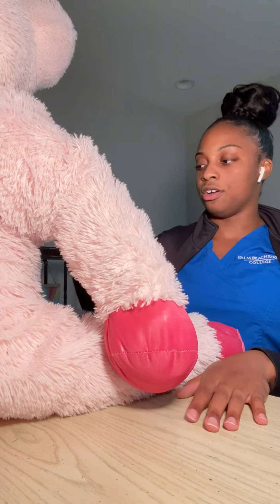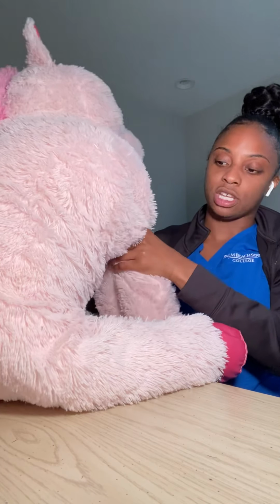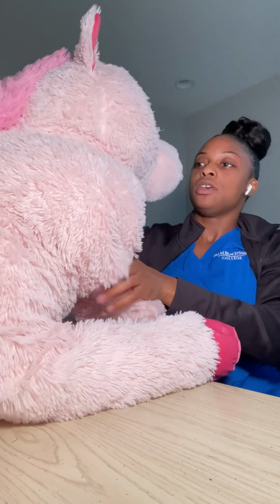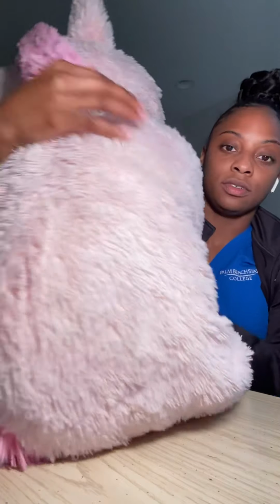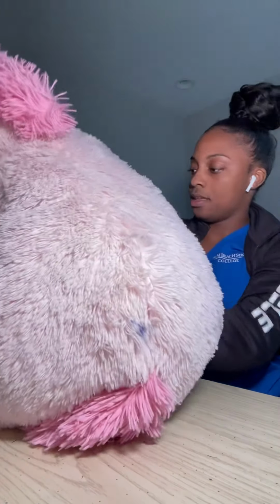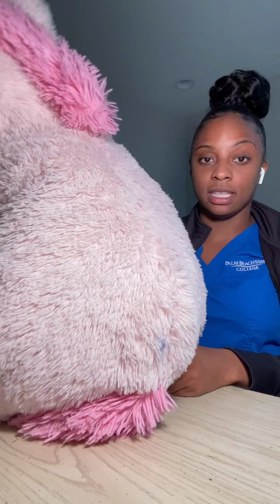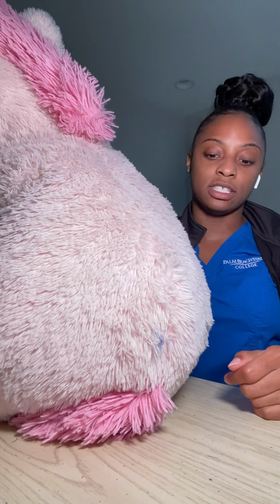So I've got her sitting up on the side of the bed. She's going to be leaning up and arching over so that the doctor can have a great view of the back. Okay? So once that's done, I'm going to let her know she needs to take deep breaths. My physician has made it to the room and he's ready to go ahead and insert it.